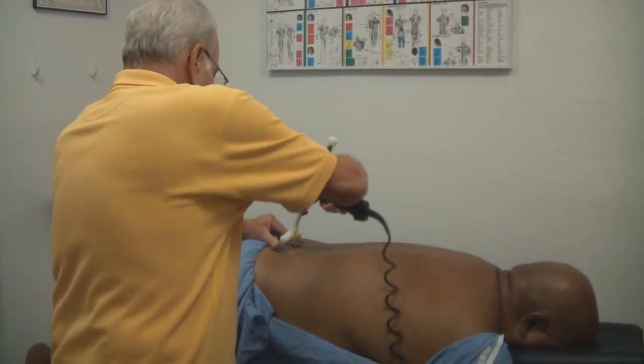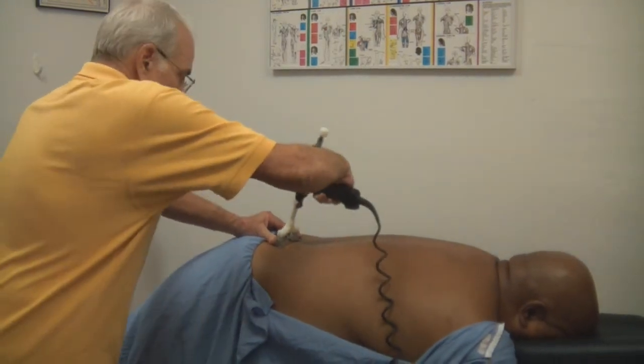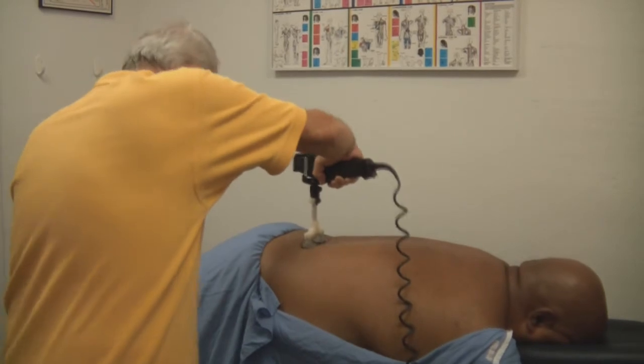We want to talk about the disc. So now I'm bringing him up to make a longer throw. We have a longer throw now going.